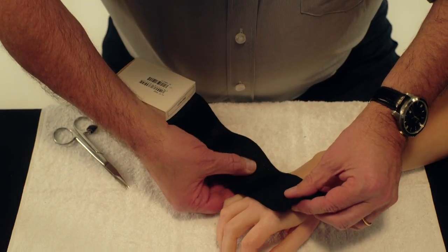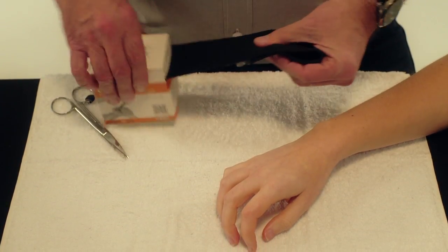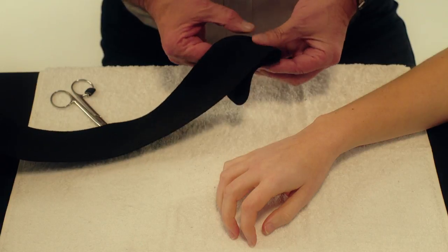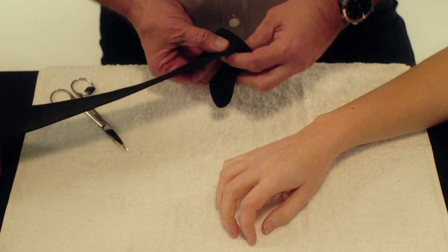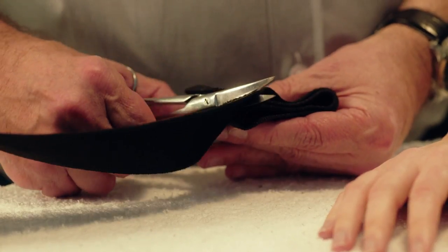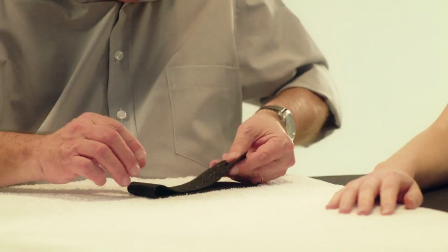Use a strip of OrphiCast which is 6 cm wide and 4 times the width of the hand. Fold the OrphiCast in half widthwise.